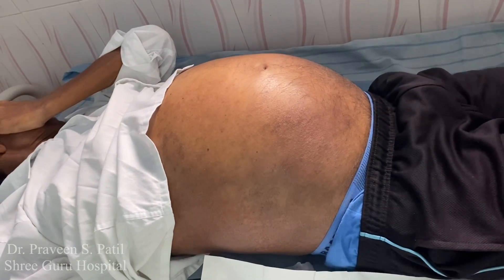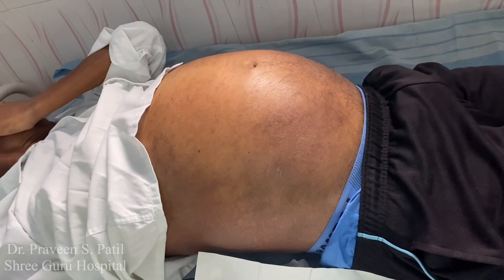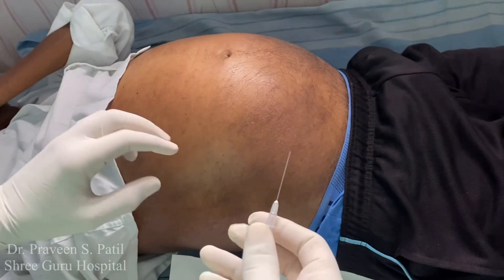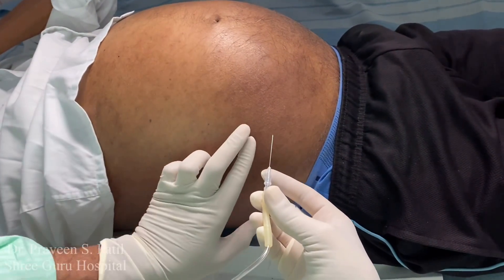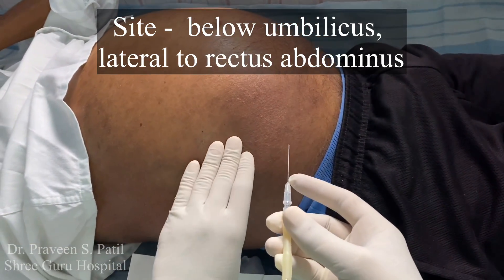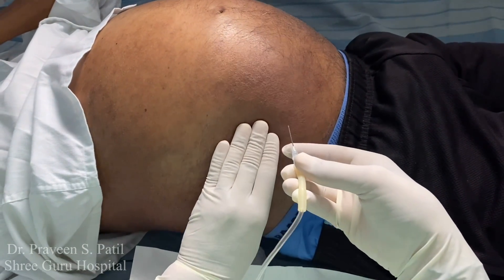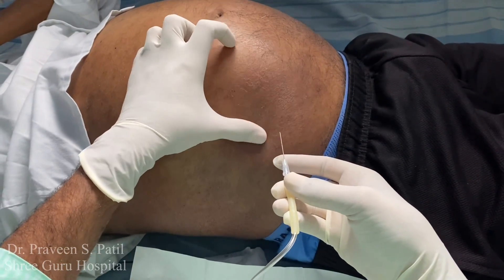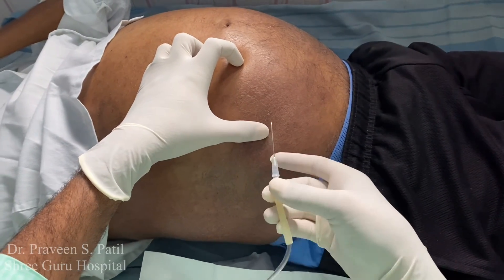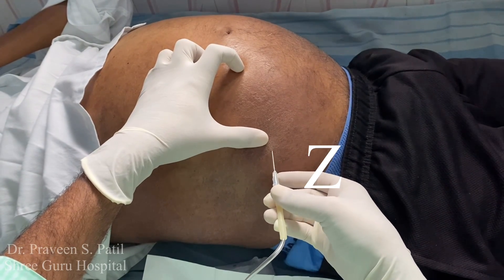Here I am using the Z-track technique, which holds particular importance in performing paracentesis. The Z-track technique allows for decreased ascitic fluid leak following paracentesis by displacing the needle track with respect to the epidermis and the peritoneum. If possible, you can slide the skin over, but in cases of overdistended patients where sliding is not possible, you follow the Z-track technique: the needle is inserted in one direction initially, then the direction is changed before entering the peritoneal cavity.